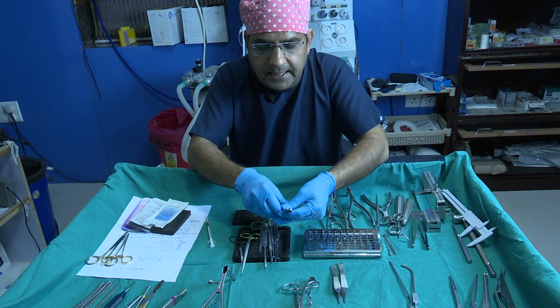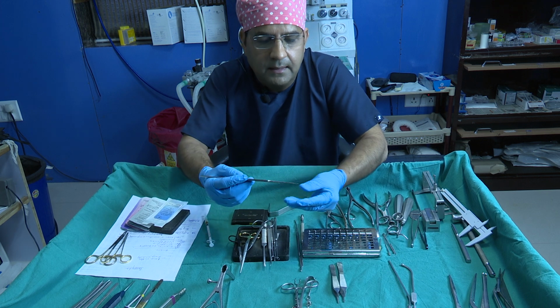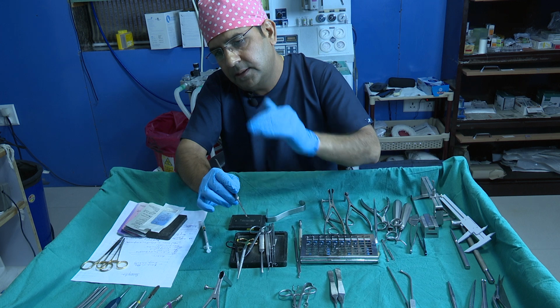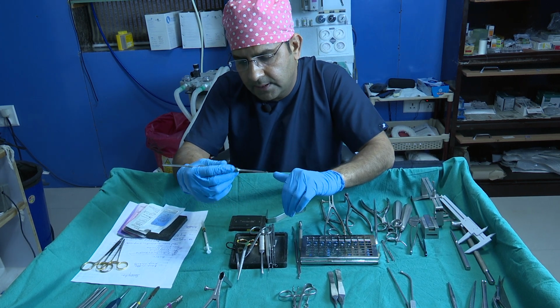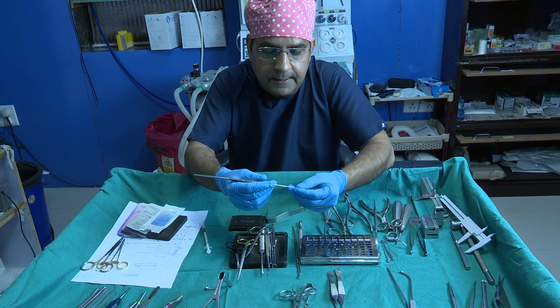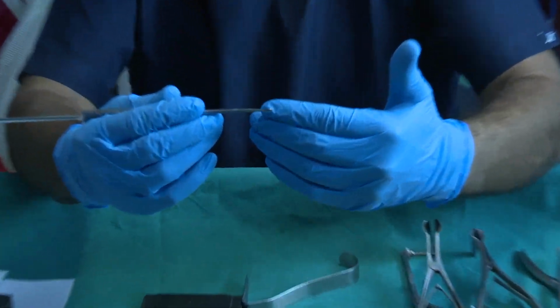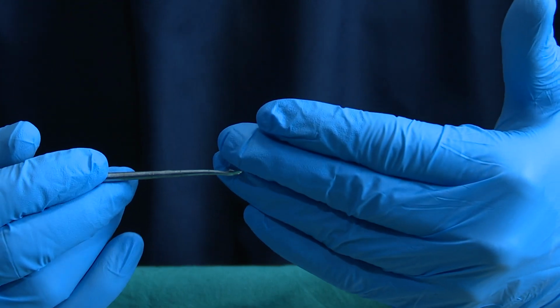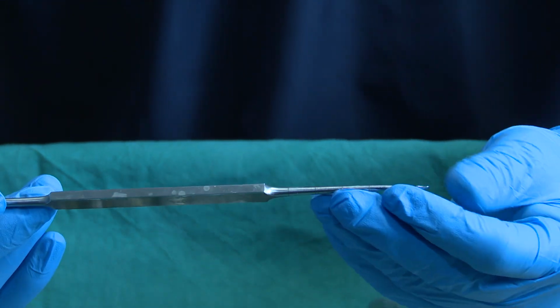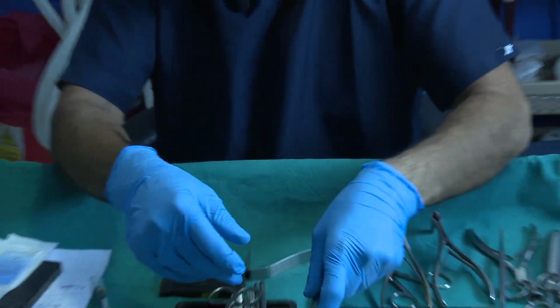Now after the exposure of the septum for septoplasty, we use this instrument again when we detach the attachment between the perpendicular plate and the septal cartilage. Look, this end is very useful, because with this suction you can break the junction between the perpendicular plate and the septal cartilage. So this is a very good instrument for this.